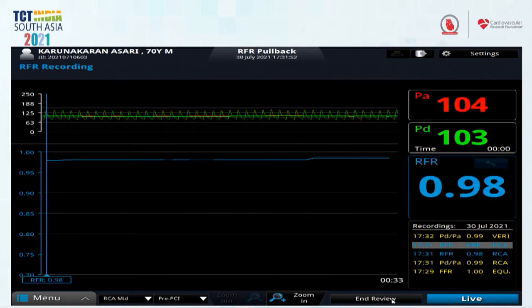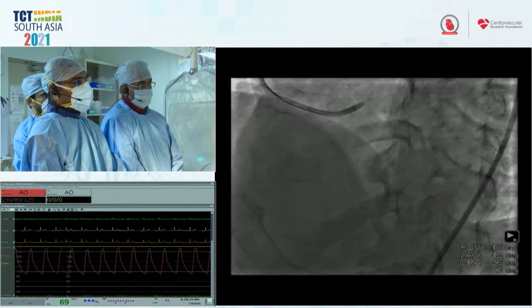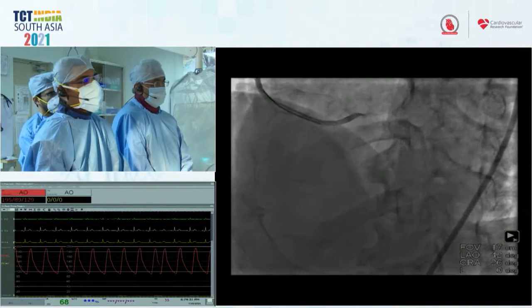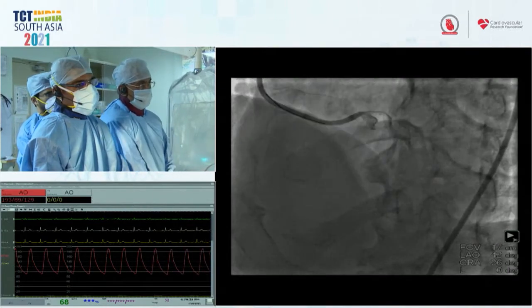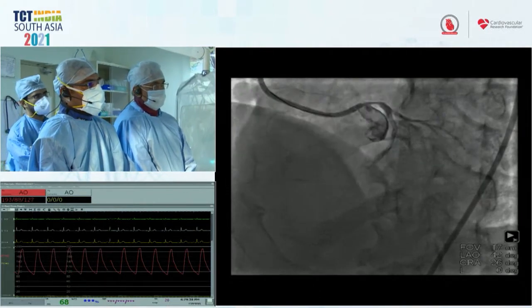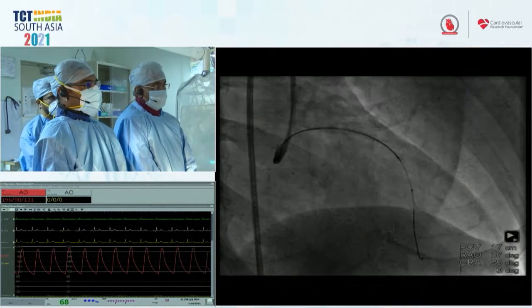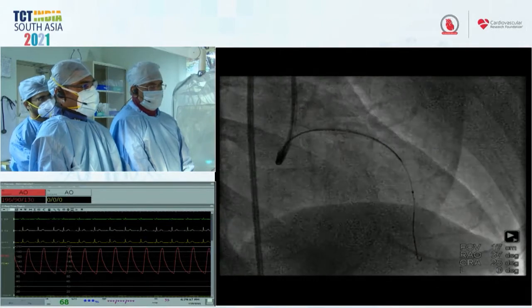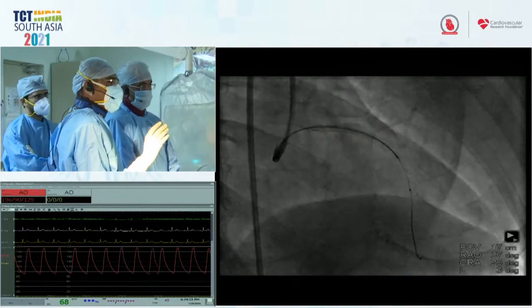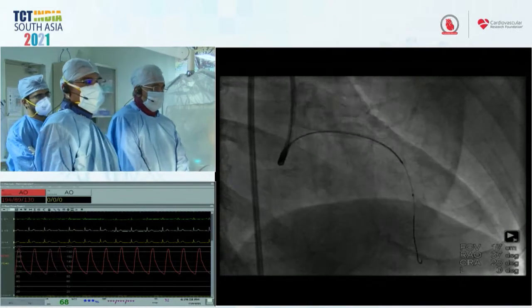Show the left angiograms, please. So you can see on the left, this is the LAO cranial. You can see a very tight ostium of the left main. There is a bit of the ostium, and then the lesion, which is very tight in the LAD. This is after nitroglycerine. The LAD otherwise looks not very significant. The previous operator did an exact ostial positioning of the stent in the LAD. So now this is what the IVUS showed. Just go through the IVUS.